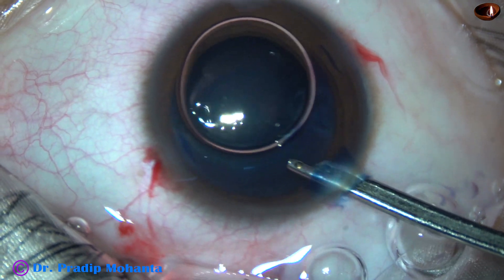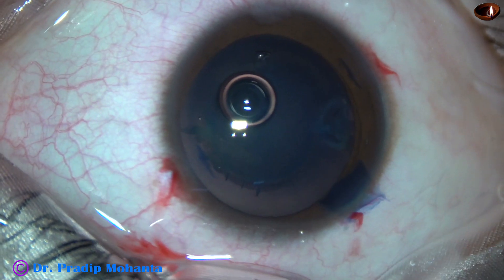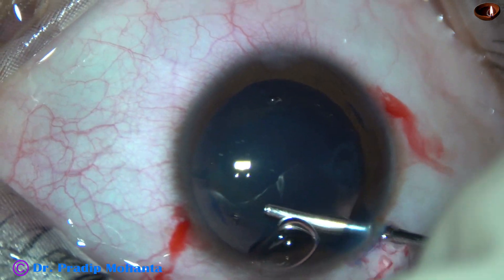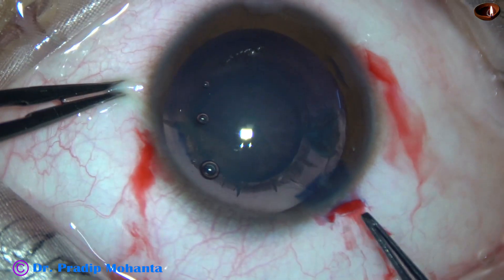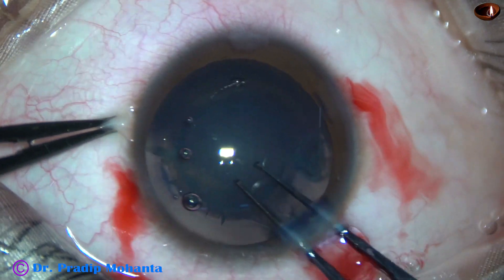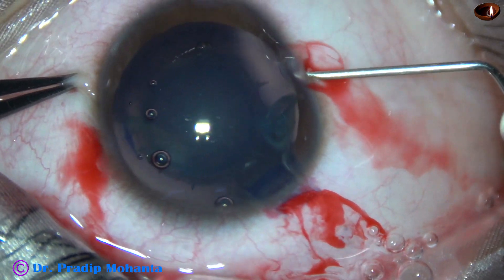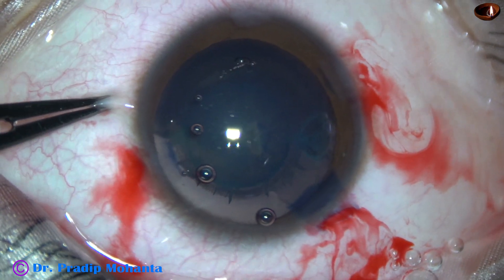The anterior capsule has been stained with trypan blue dye and now we are going to do capsulorhexis. The anterior chamber is filled up with 2% hydroxypropyl methylcellulose. As I try to make a puncture onto the anterior capsule with the utrata forceps, after five attempts I cannot pierce the anterior capsule. So I take a sharp needle cystotome and make a puncture and raise a capsular tag.